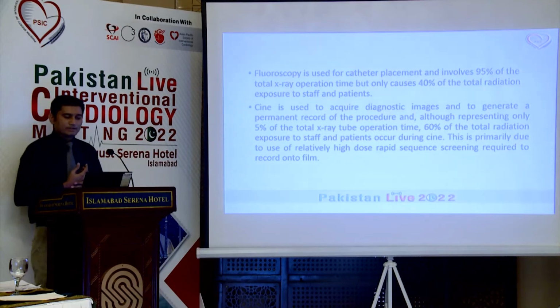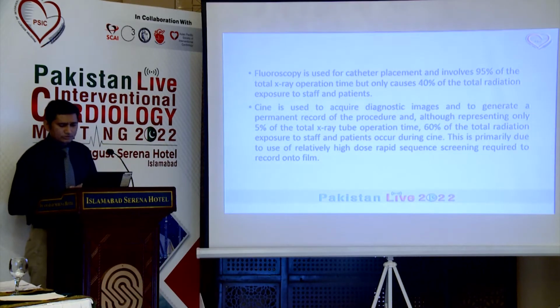Cine is used to acquire diagnostic images and to generate a permanent record of the procedure. Although representing only 5% of the total X-ray tube operation time, 60% of the total radiation exposure to the staff and the patient occurs during cine. This is primarily due to the use of relatively high dose rapid sequence screening required to record onto the film.